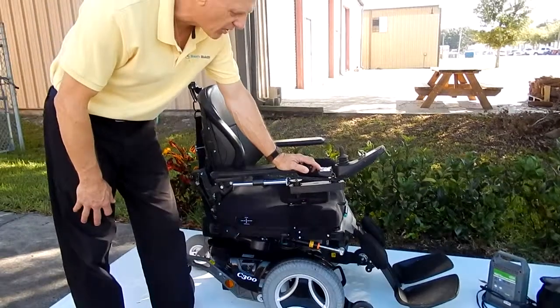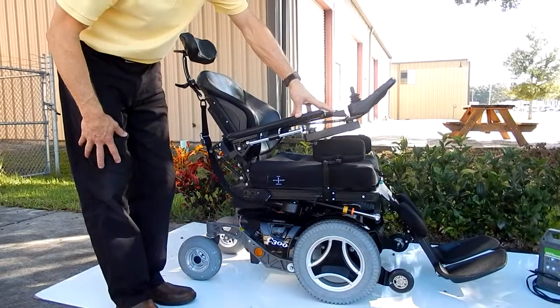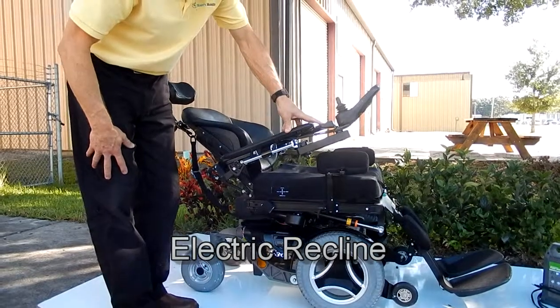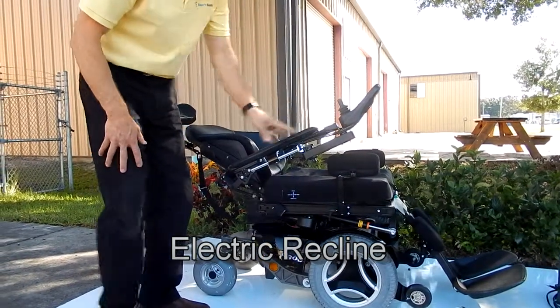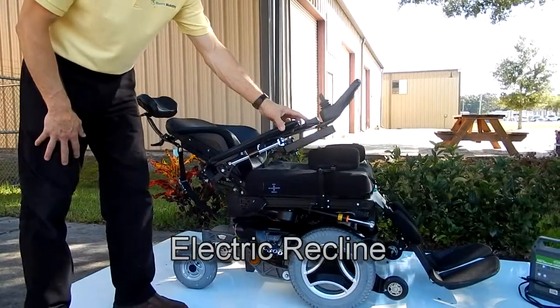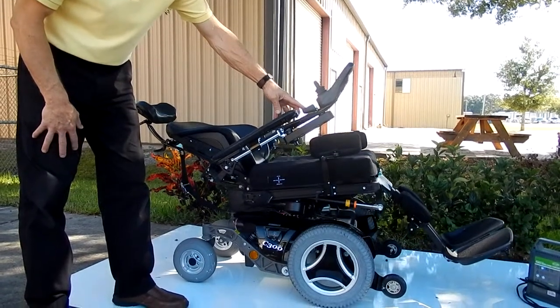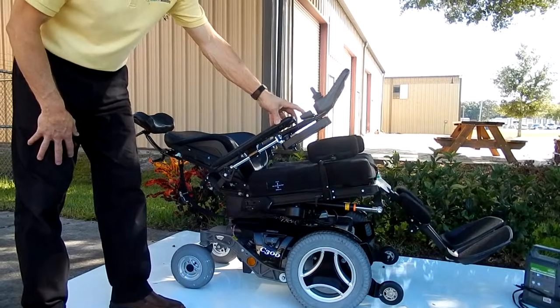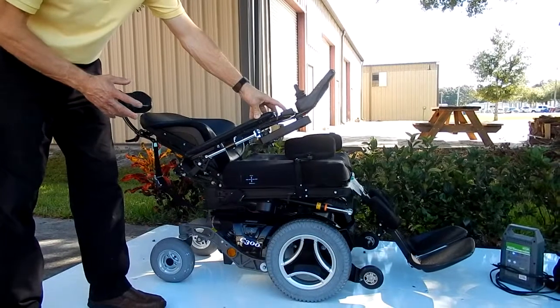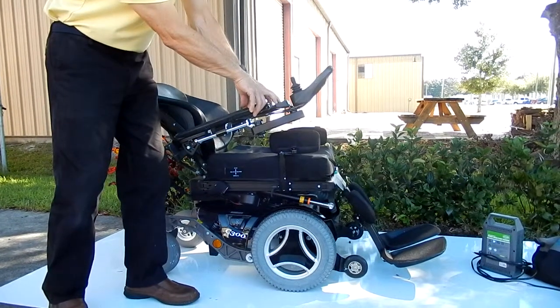This chair also has partial recline, so we're going to have the back going back here. This is partial recline — it's almost full recline, but if you need more recline, you can also go up with the tilt and get more recline by tilting the chair back. You can work this chair with multiple functions, multiple ways. This chair also has electric legs — I'm going to bring the seat back up and work the legs so you can see them going in.